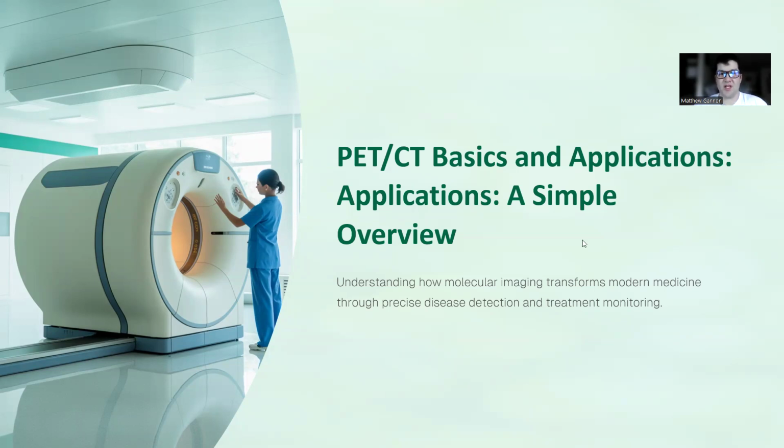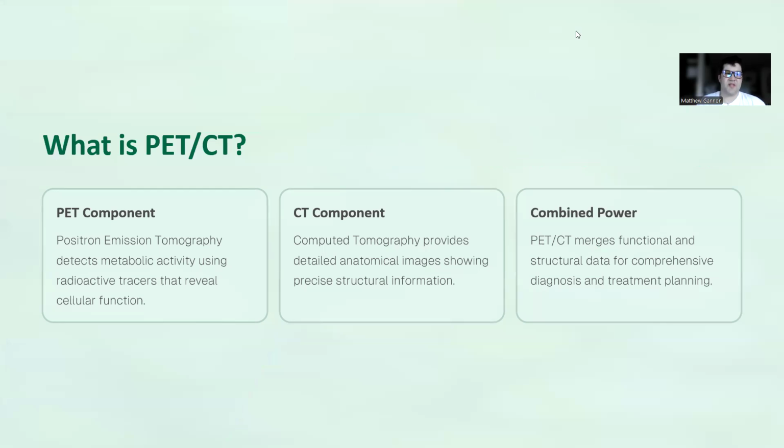Okay, so let's get started. This is a presentation for PET-CT basics and applications, a simple overview. Hopefully by the end of this, you'll get an understanding of what PET-CT does. It's two different imaging modalities that are fused together to get a diagnosis and complete an objective. So what is PET-CT? Let's get into it.